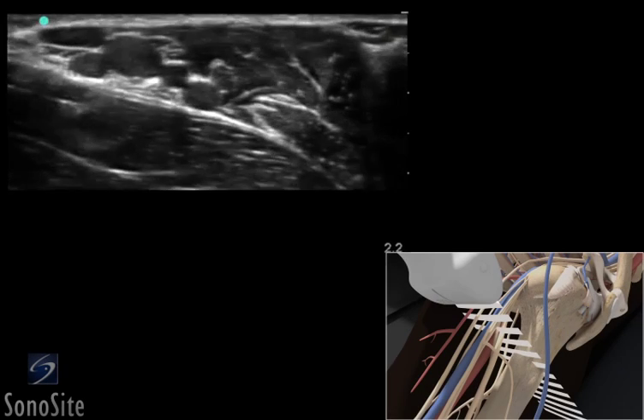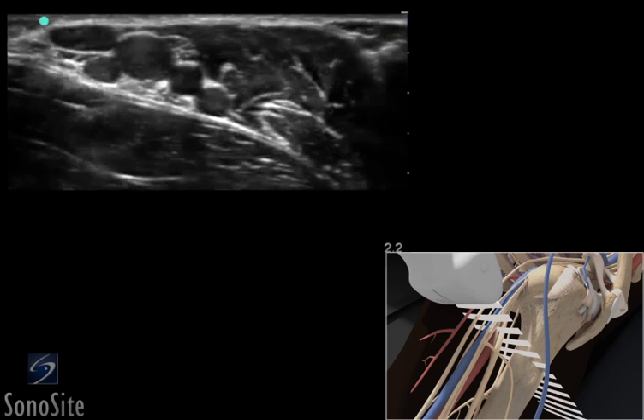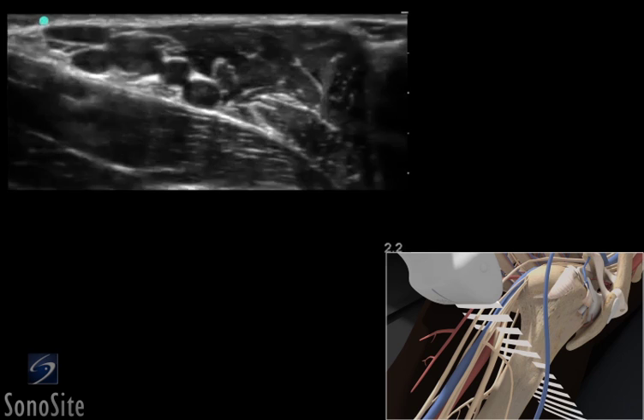A linear array transducer with a nerve exam type is used to perform an ultrasound-guided axillary regional nerve block. The target depth is approximately 1 to 2 centimeters in an 80-kilogram adult.